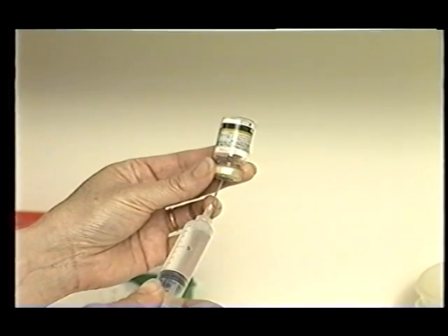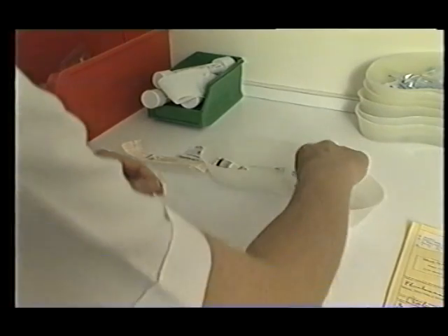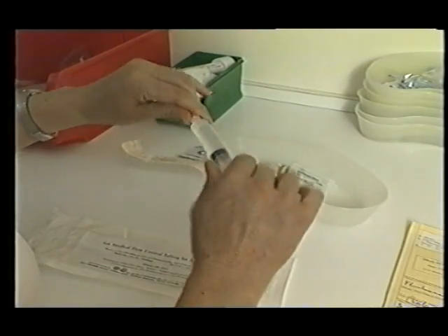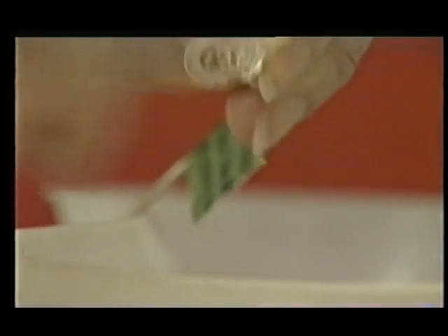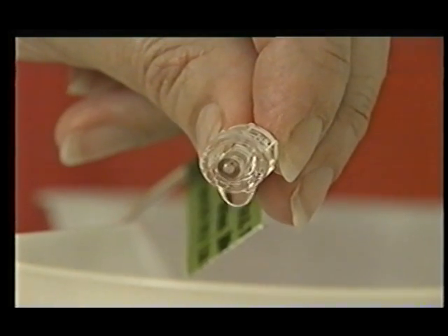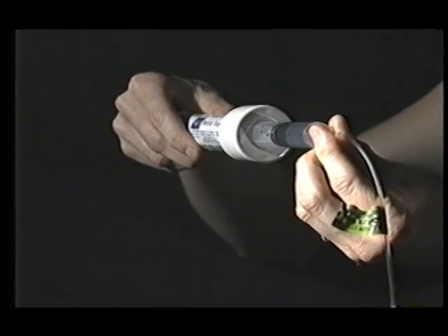To use the standard Spring Fuser models, simply fill the syringe, attach the flow control tubing, push the syringe into the Spring Fuser and twist to lock into position. Finally, prime the tubing by removing the cap. It's now ready to be connected to the patient. A word of warning: do not disconnect the flow control tubing while the syringe is in the Spring Fuser.